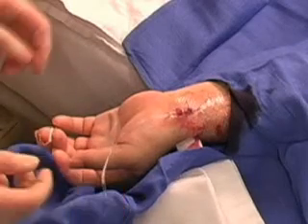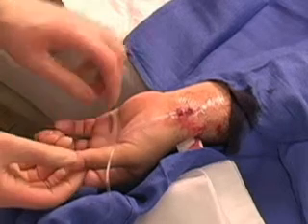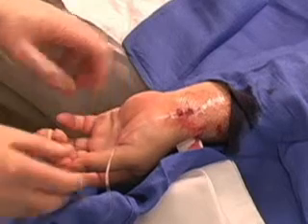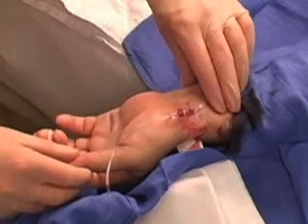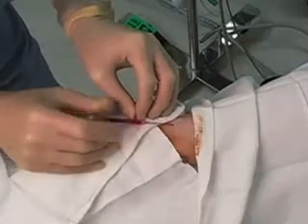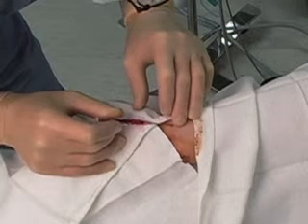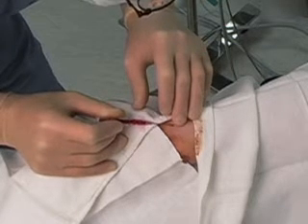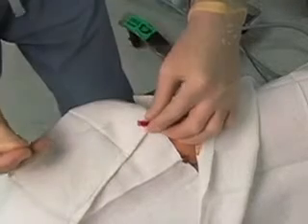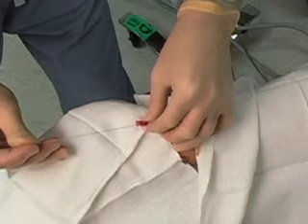Once the arterial line has been secured in place and the transducer connected, perfusion to the extremity should be rechecked. Perfusion should be checked periodically throughout the time the arterial line remains in place. There are some common problems that can occur during arterial line placement. If, in the over-the-needle technique, no blood return is obtained after the initial flash, the catheter can be advanced through the vessel and the over-the-wire technique can be employed.